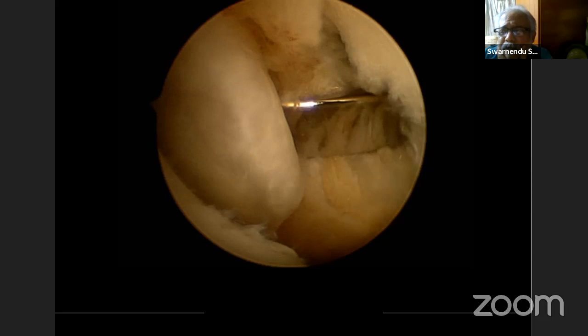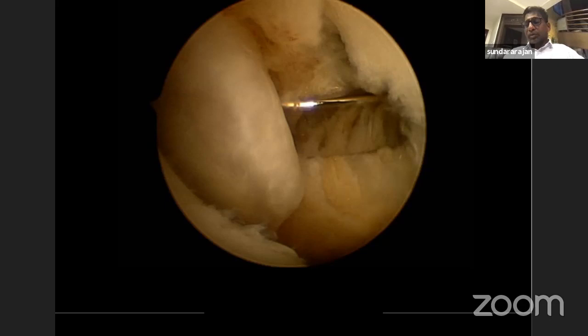When you do an arthroscopic ankle arthrodesis, and I do quite a number of them, the advantage of arthroscopic is you are not destabilizing any ligaments on the medial side and lateral side. So your stability is maintained. So the role of the screw here is very minimal, just to compress the talus and tibia. So we don't need to worry too much about instability issues in arthroscopic ankle arthrodesis. That's why even two screws from medial to lateral, perpendicular to each other, is more than enough.